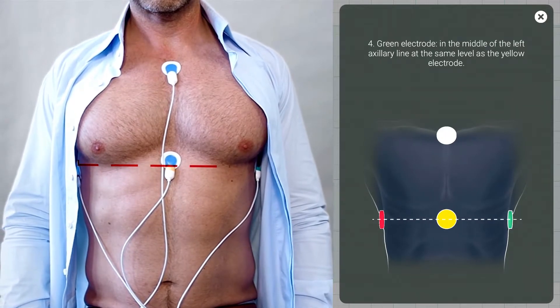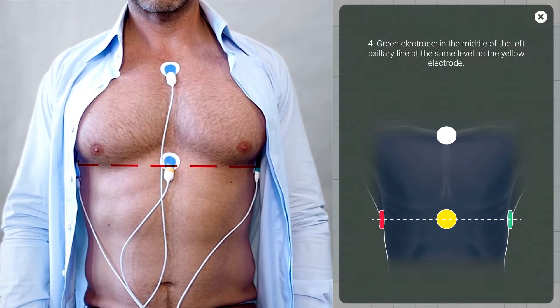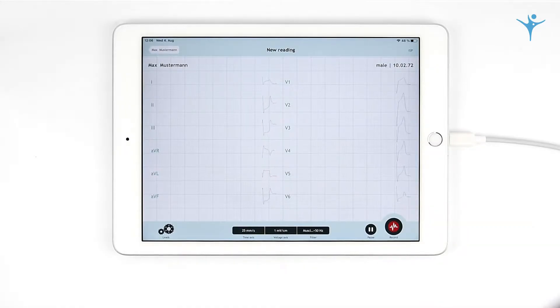The red, yellow, and green electrodes form a horizontal line. Initially, the viewing mode will show the following. Simply record an ECG by pressing New Reading. The recording duration will show in the top bar.